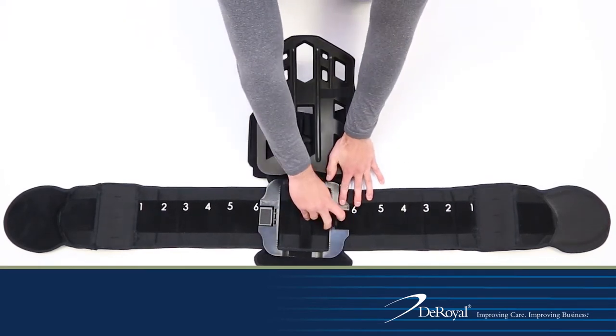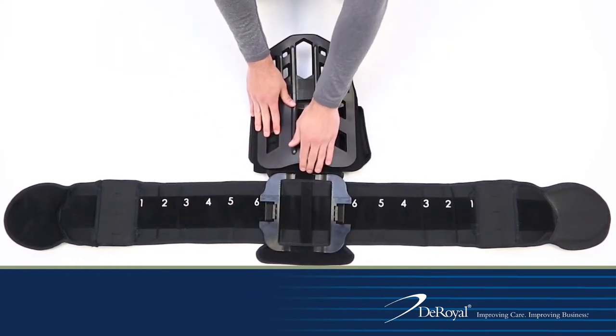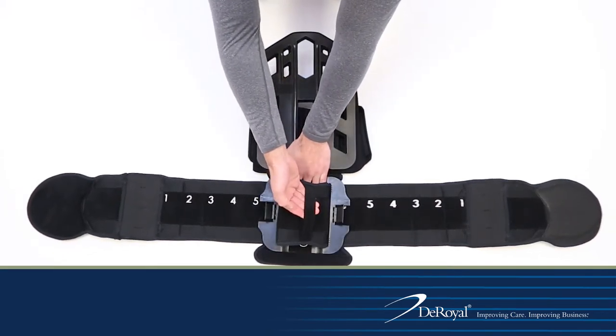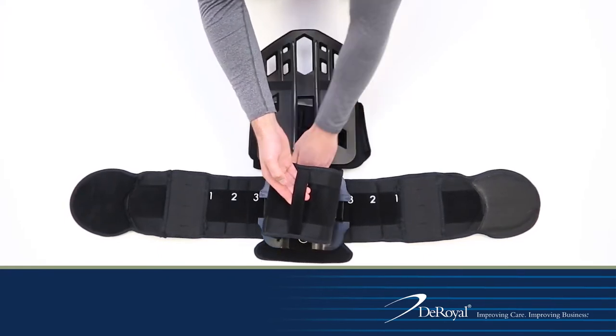Pull up on the two belt security hook flaps located on each side of the adjustment mechanism until they reach a 45-degree angle from the belt. Place one hand under the belt pull strap near the indicator and use the other hand to pull straight upward on the belt pull strap until the appropriate size zone is reached.